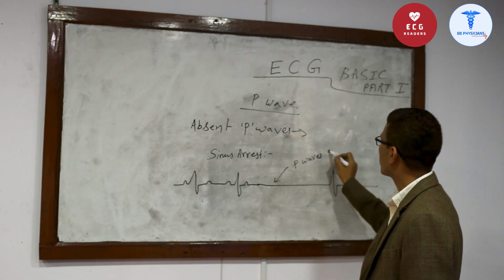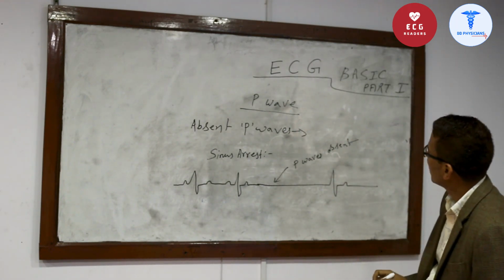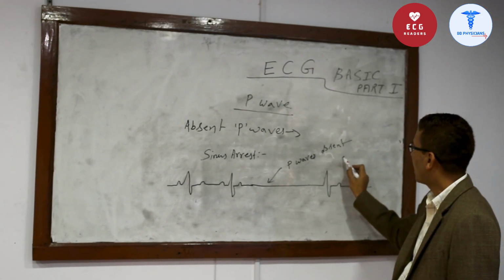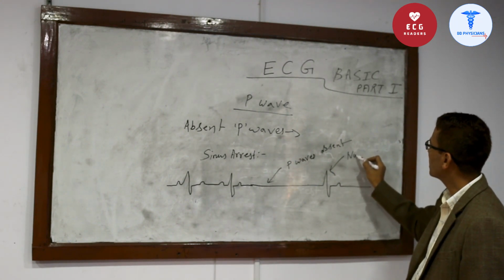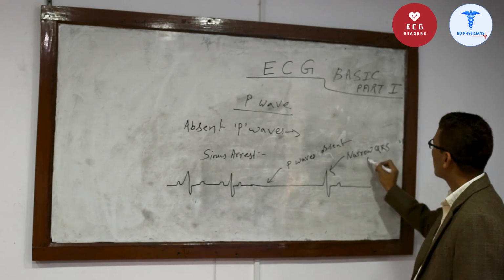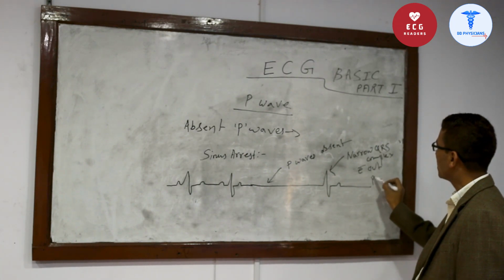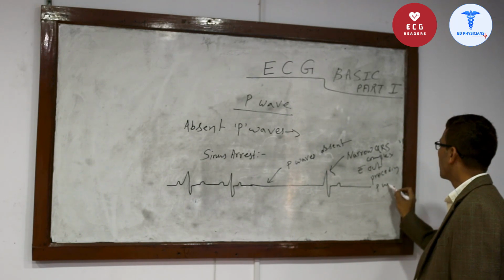P waves absent, and there will be some pause. P wave will be absent, and after some duration, there will be a narrow QRS complex, QRS complex without preceding P wave.